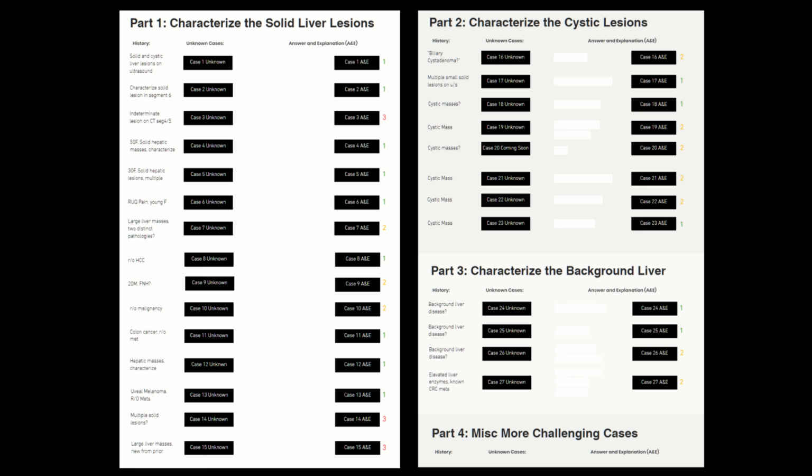Next, I want you to apply what you've learned in this video by taking the liver MRI cases in our liver MRI course, which includes all of the most important pathologies that you need to know, walkthroughs of imaging findings, and everything that you need to know about each case. So we cover how to characterize focal solid and cystic liver lesions, diffuse liver diseases, and some more challenging cases.